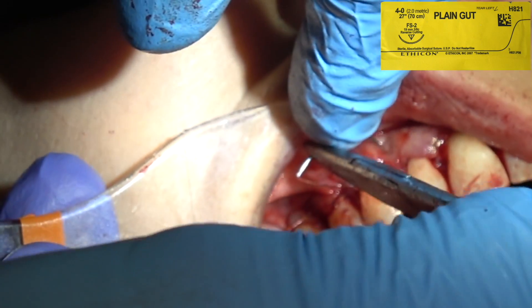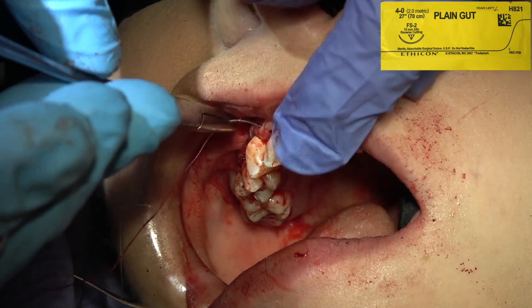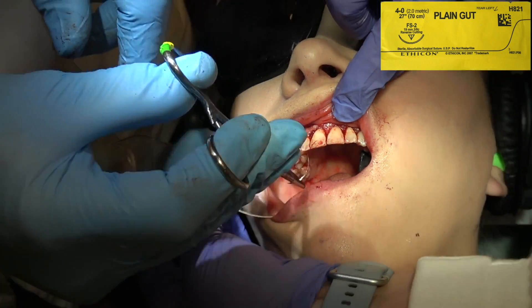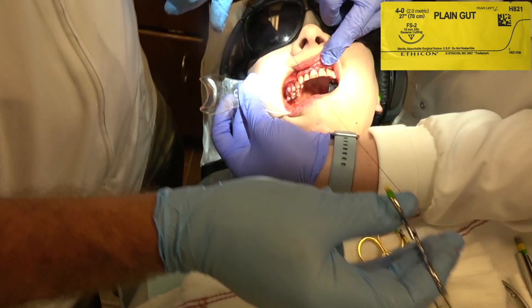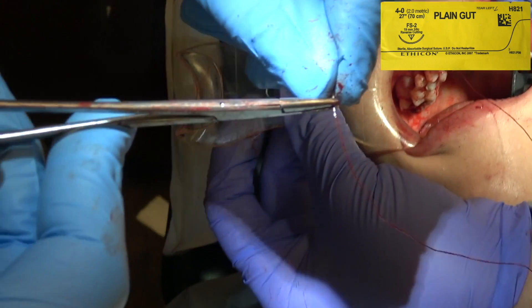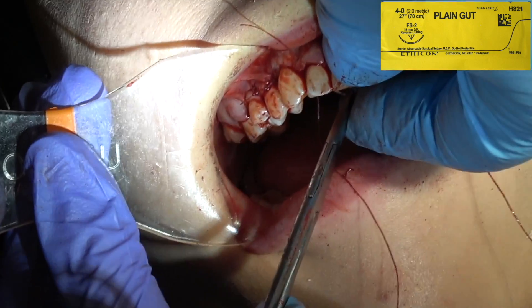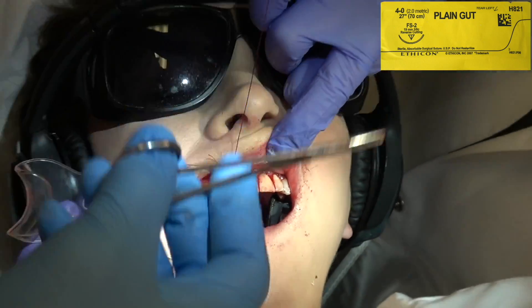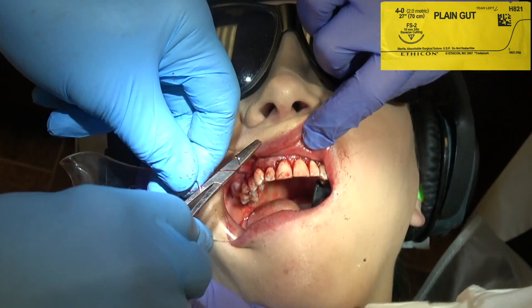These are all interrupted individual sutures. I don't want a mattress suture or any long suture, because if it broke then you've lost all your suture. You want to do interrupted, individual sutures when you're doing periodontal crown lengthening, in my opinion.